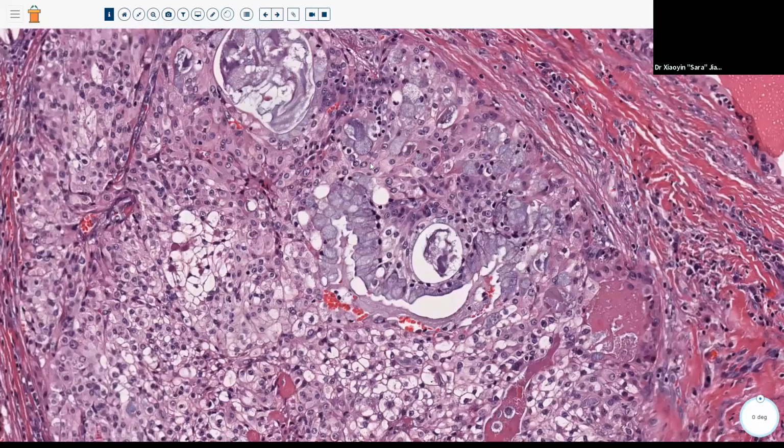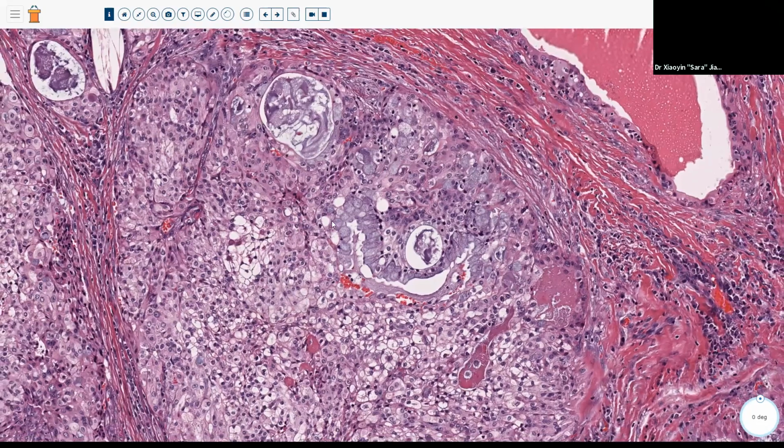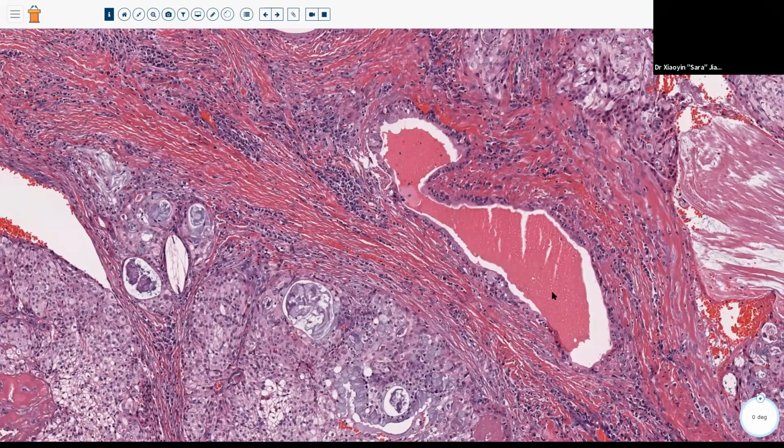Here we have some nice mucocytes. And then there's some cells that are kind of in-betweeners or intermediate cells. And so if you've got a tumor that's got some more squamoid or epidermoid cells, some mucocytes, and some cells that maybe aren't one or the other, and has some cystic areas as well, so what am I describing? Mucoepidermoid carcinoma, right? The most common malignant salivary gland tumor.